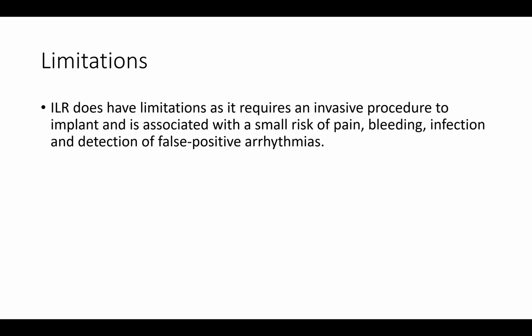So that is one of the key things that makes me keep reminding them that if there is a symptom, come that very particular day so that we'll be able to see it. Because if a patient had a symptom 6 days ago and is coming after 6 days, more recordings must have already been done, and you may not see what the loop recorder showed during that symptom.